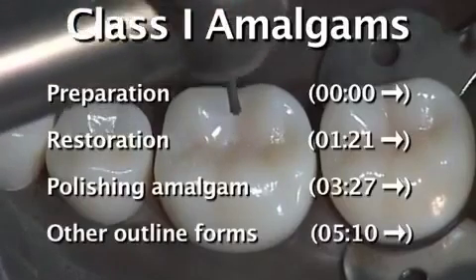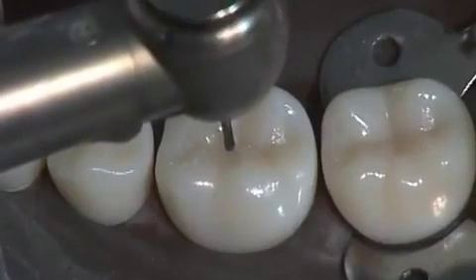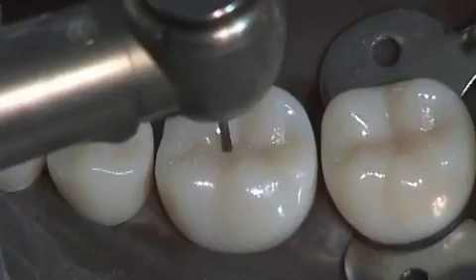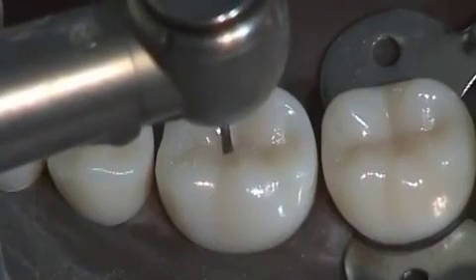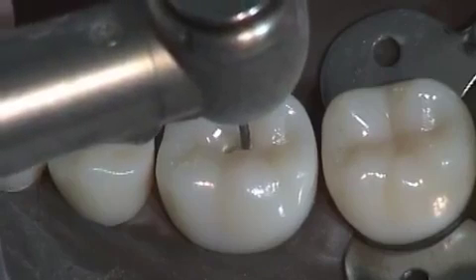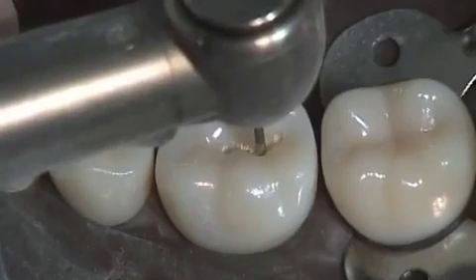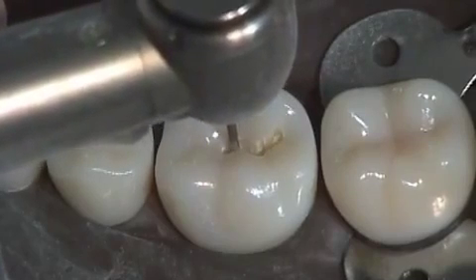First, after anesthesia and isolation, use a carbide or diamond burr in a high-speed handpiece to create the initial punch cut where the caries is most involved. This is typically at the center of a groove or fissure. A carbide burr is generally preferred for amalgam because of the smoother walls it leaves behind.